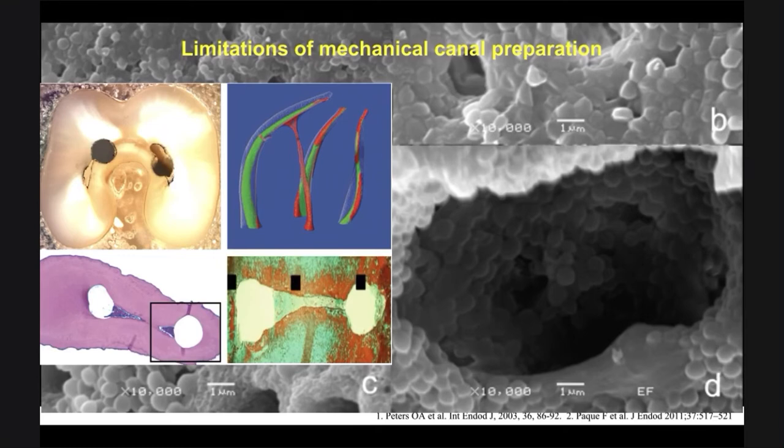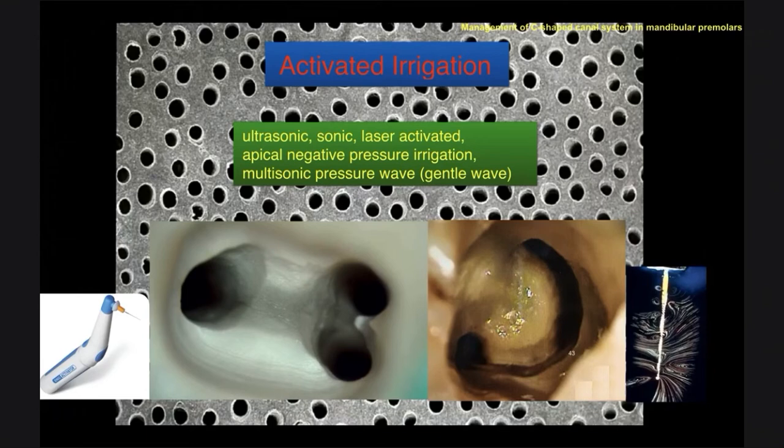Contemporary root canal instrumentation procedures are actually not capable of contacting more than 35% of the root canal walls. So the anatomical irregularities of the root canal systems, such as the isthmus, the canal fins, the cul-de-sacs, and the apical delta, are not accessible to the instruments, which will leave much biofilm-covered surface and infected dentinal tubules in these regions. Therefore, root canal irrigation is quite necessary for reducing the biofilms in the root canal systems, especially in the C-shaped canal system.